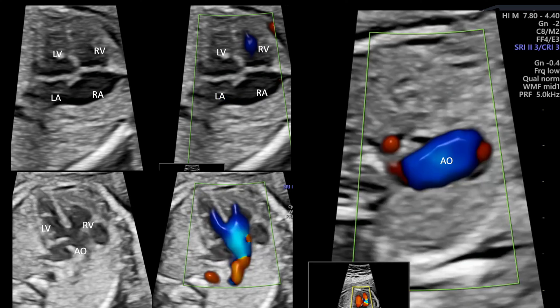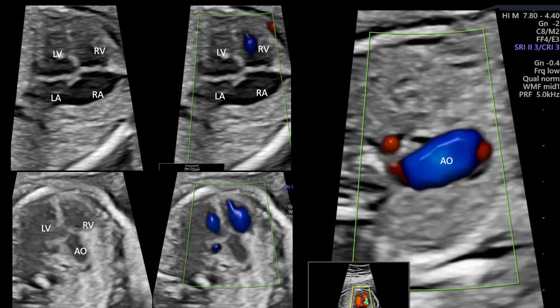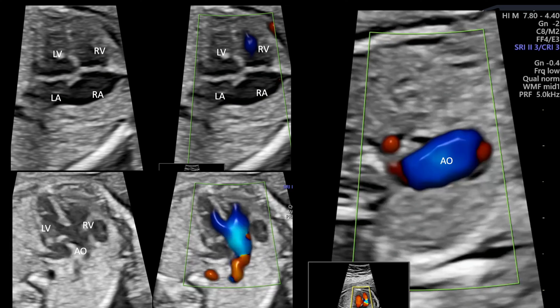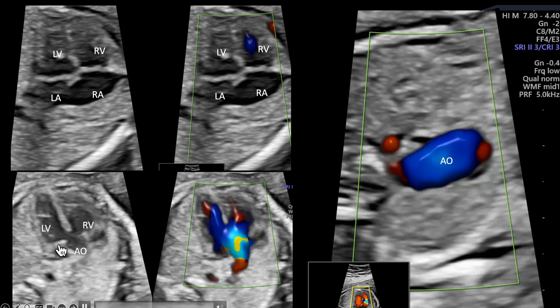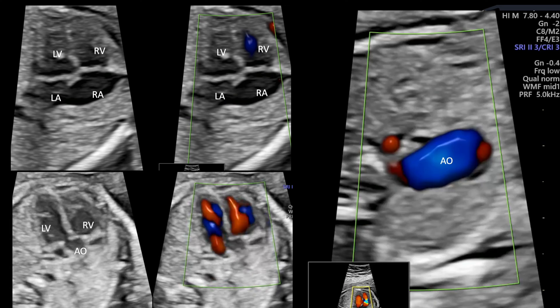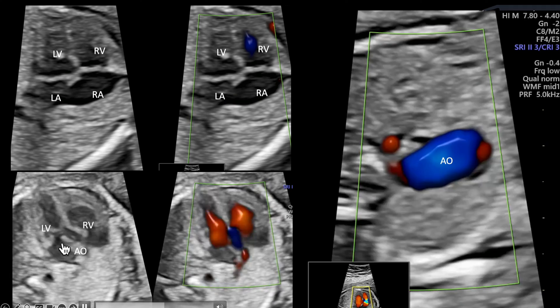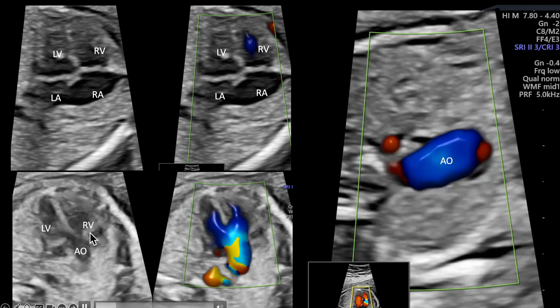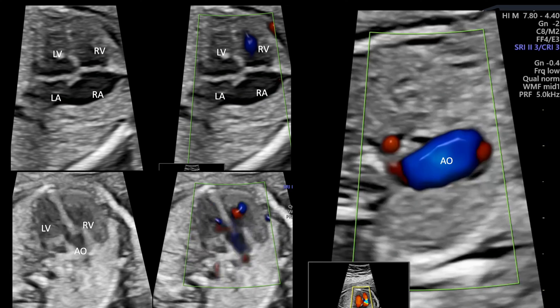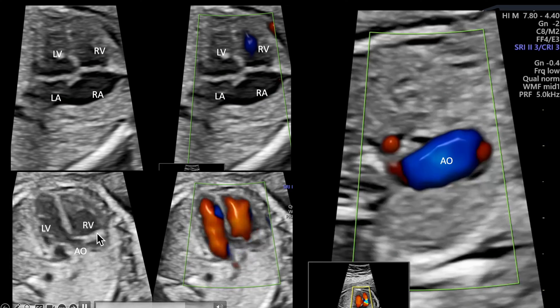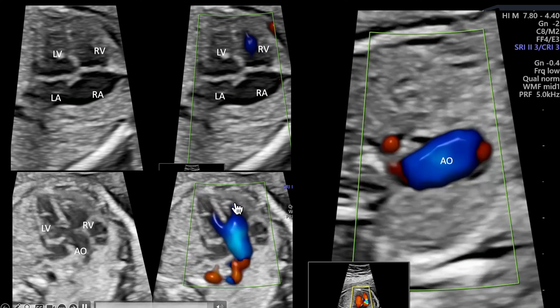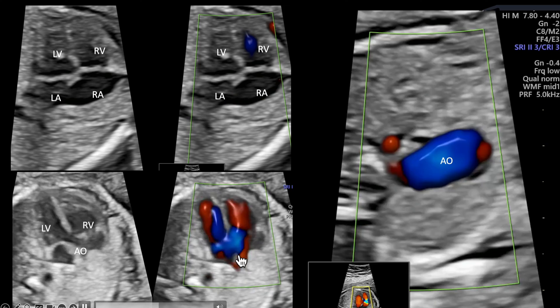When we tilt to the next view — the apical five-chamber view or LVOT view — where we see the aorta coming out of the left ventricle, we notice a very interesting thing. There is a large VSD and there is an aortic override of about 50 percent, with blood coming from the right ventricle and the left ventricle filling the aorta.